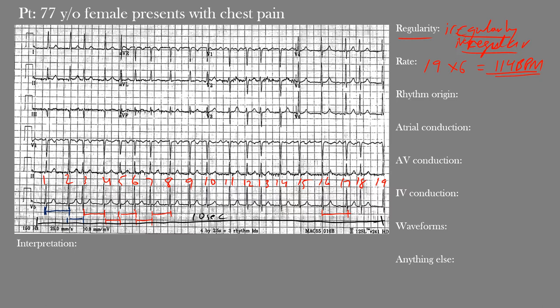Now, how about the rhythm origin? We have narrow QRS complexes, so it must be a supraventricular rhythm, meaning it's originating above the ventricles. However, you can't really make out any P waves here, so it's certainly not a sinus rhythm. It must be coming from somewhere within the atrium. With ventricular rhythms we usually see wide QRS complexes, but here the narrow complexes confirm the rhythm origin is likely from the atrium.